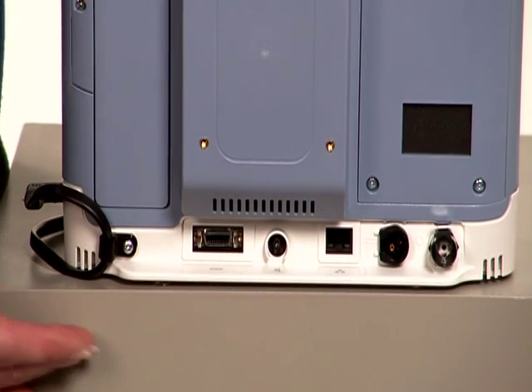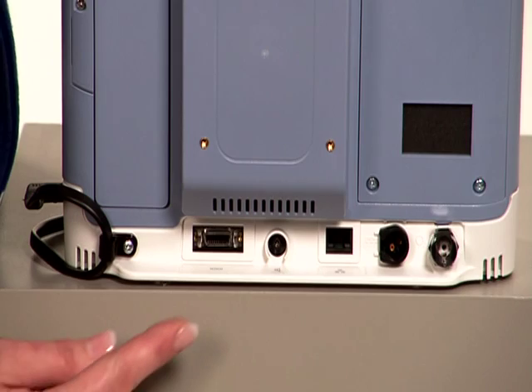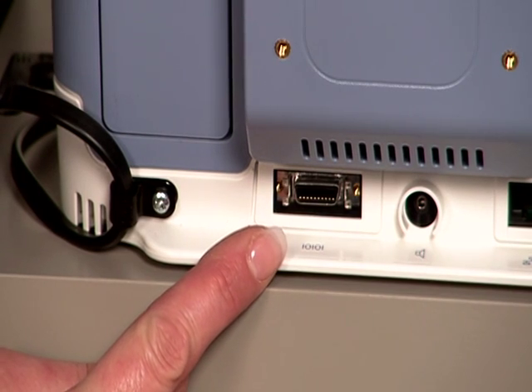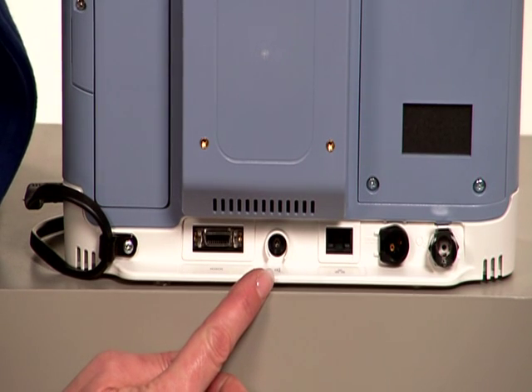Looking across the bottom, there are a number of connections and ports. You can secure the power cord using the cord retainer. A serial connector lets your home care provider connect Trilogy100 to a computer or another Philips Respironics device. If you use an optional remote alarm, you attach it here to the remote alarm connector.